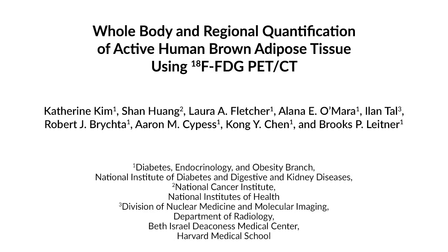Using this method allows researchers to obtain highly quantitative measures of active brown adipose tissue, or BAT, in human subjects. Our methodology is designed to avoid common false positives and provide in-depth instruction on how to identify and classify brown adipose tissue depots. The main advantage of this technique is the exclusion of false positives and the classification of metabolically active brown adipose tissue depots.